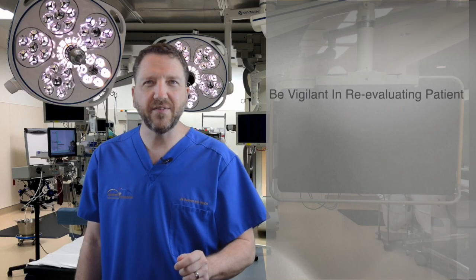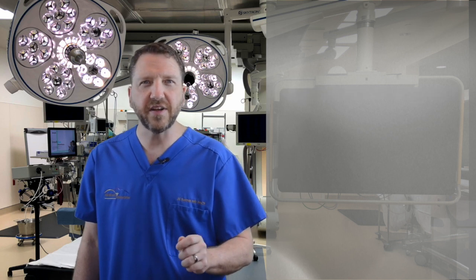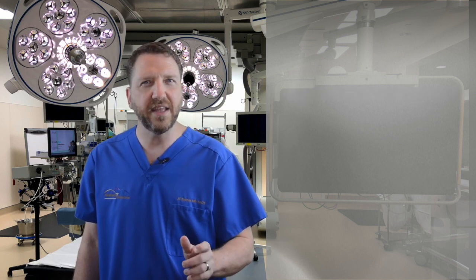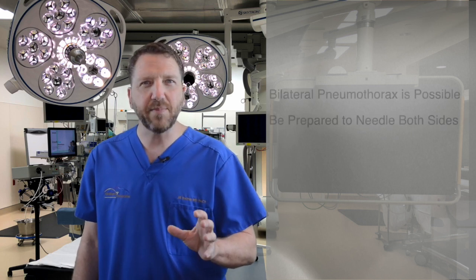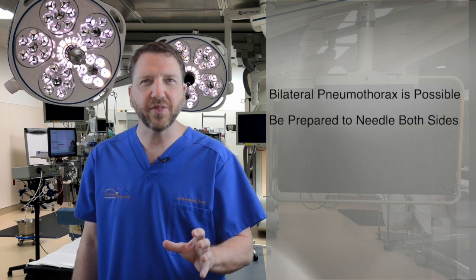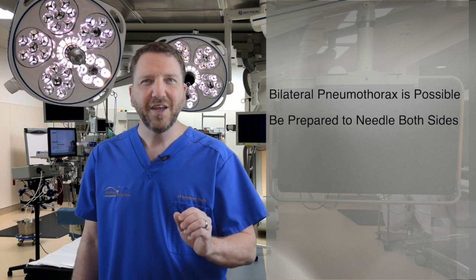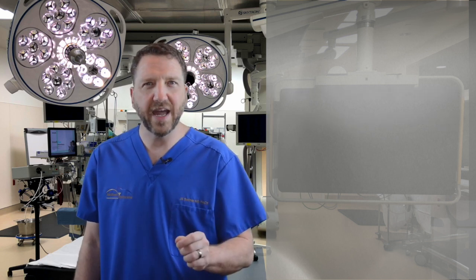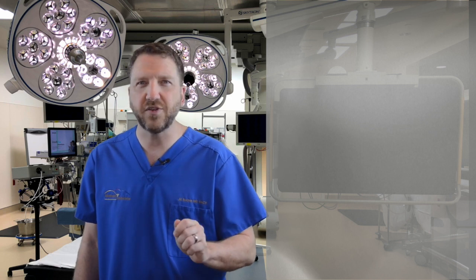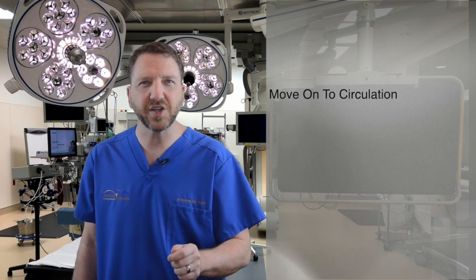Be vigilant in re-evaluating your patient. If the first catheter is ineffective, you may need to insert a second catheter on the same side. It is also possible to have bilateral tension pneumothoraces — be prepared to needle both sides. If your patient remains in distress despite two catheter placements on that same side, don't go for a third. It's time to move on to circulation.